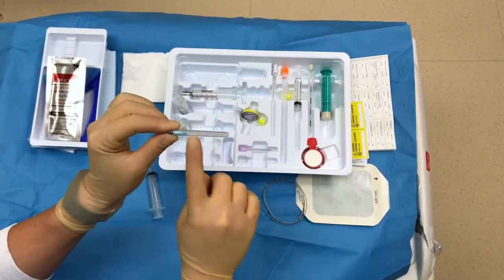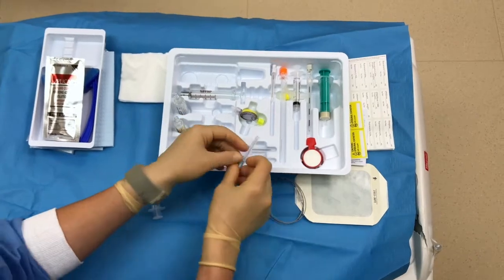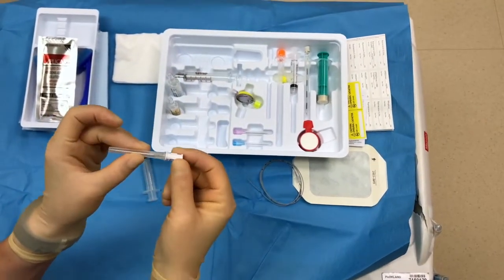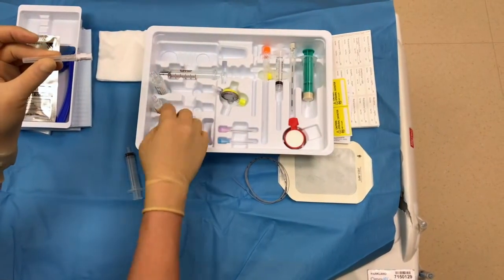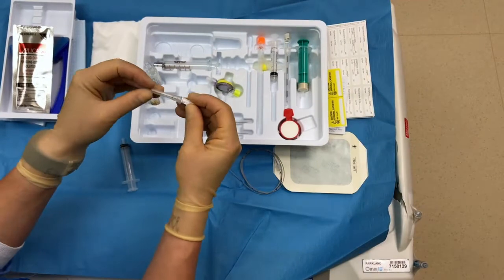Here's your 22 gauge that you'll use for your local. So it's a thinner needle. Here's a filter needle, the one with the white tip here. That's what you're going to use to draw up any of your medicine, especially your lidocaine, and then your spinal solution.